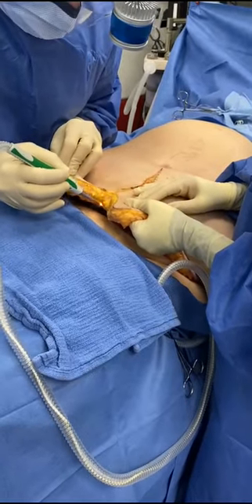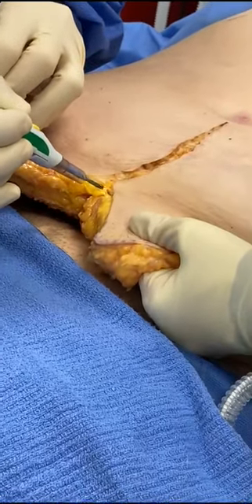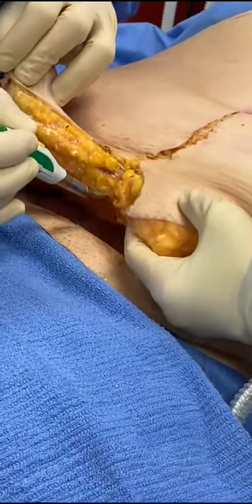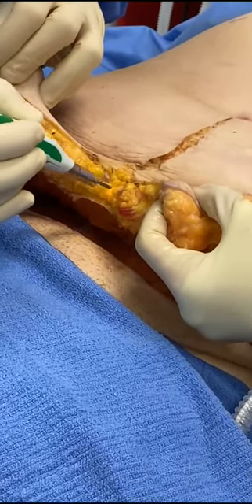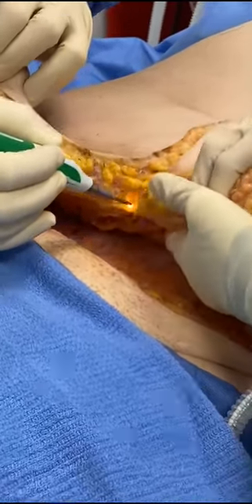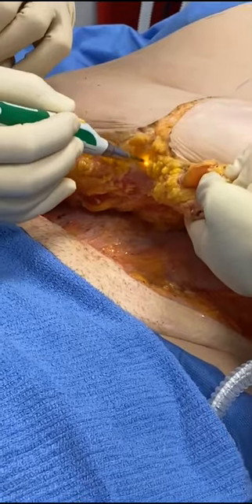Alright, so there's some blood vessels here, but notice the complete absence of bleeding, huh? It's incredible. There's a little blood vessel here. So what I do is I electrocoagulate it before I go into that area, right? And so that's how you do it. No bleeding at all here at the Cosmetic Surgical Center of Cerrito. Look at that. Incredible, huh? We're just cutting before your very eyes, and you can see how there is absolutely no bleeding here, huh?